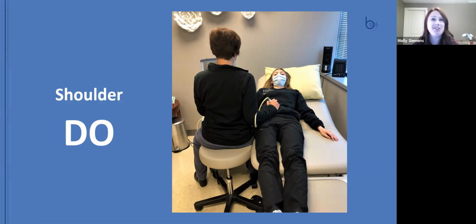One recommendation that I saw in the literature stated to have the patient stand on the table when performing this type of exam to avoid overreach. I don't know about you, but I don't think I'd feel comfortable asking a patient to stand on a table. If possible, it might be a better idea to have some sort of a tiered step stool with a handle that the patient can hold on to rather than asking them to stand directly on the table.